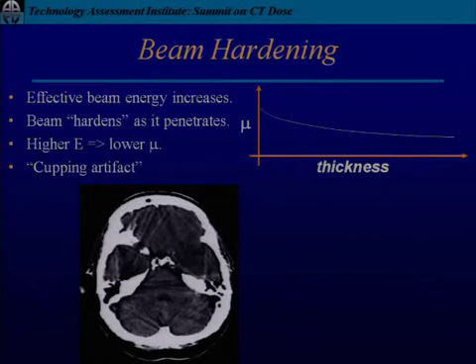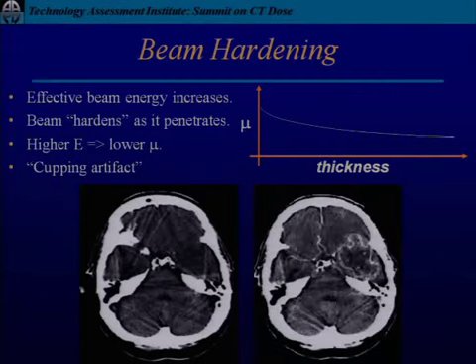Beam hardening, as everybody knows in this crowd, can be a major problem. You get all these artifacts because of the beam hardening. Over here, it looks like air, but there is obviously soft tissue. It has been sort of attenuated out because we have petrous ridges over here. So if you took a cylinder of water, you'll get this cupping effect, and everybody knows that. So you have to do cupping correction. Ordinarily, you will just pass this scan as having nothing, but there's a little bit more hypoattenuation here. If you give contrast, you see that there is a rim enhancing lesion over there.